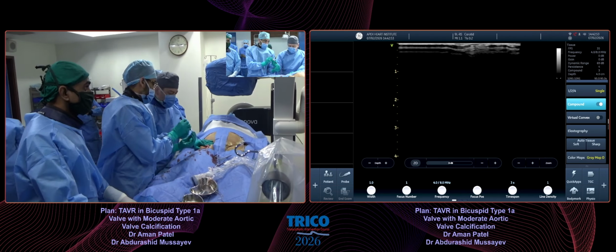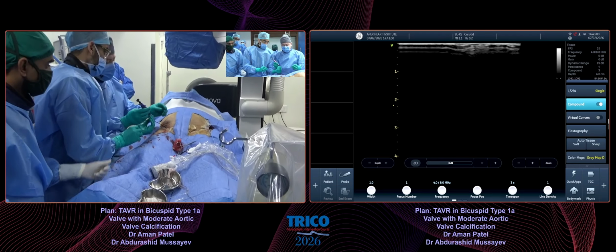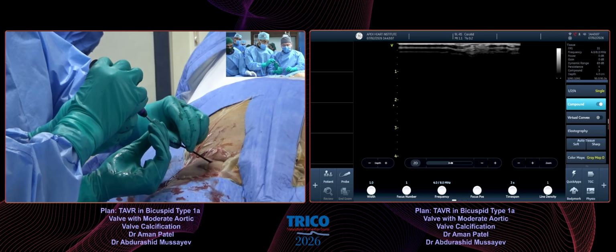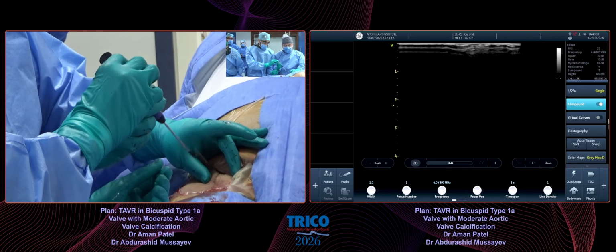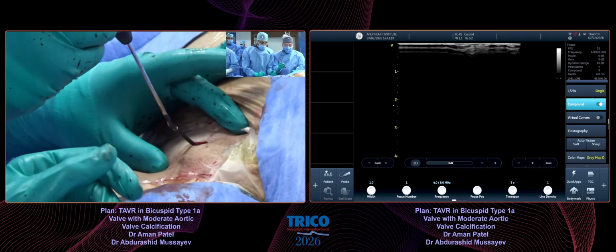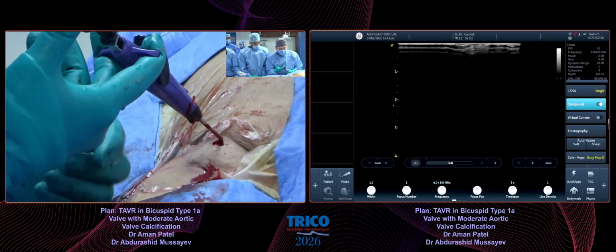Did we do the blind dissection to reach the surface of the artery before we insert the ProGlide? Usually by echo, before the insertion, we could check. By echo, you could very clearly see all the arteries, and here we use just a regular wire, and in most cases we use one ProGlide and one angioseal. Here we are planning to use one ProGlide.